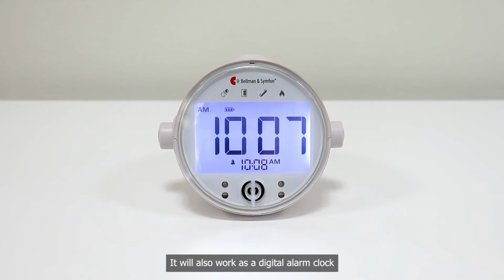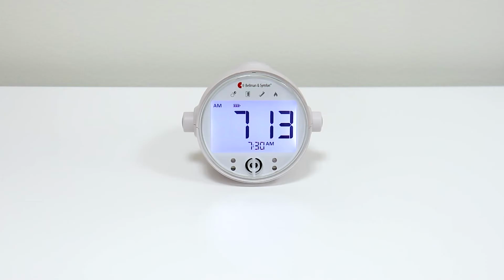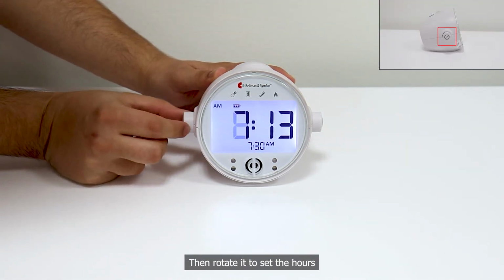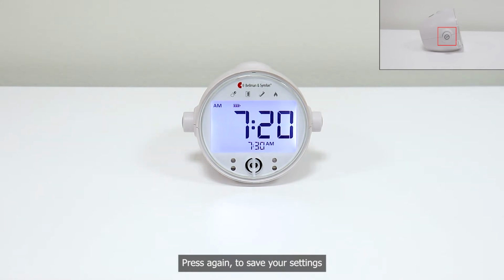It also works as a digital alarm clock, which will wake you with a loud alarm, flashing lights, and vibrations from the bed shaker when it is time to wake up. To set the time on the alarm clock, press the time setting button on the left. Then rotate it to set the hours. Press the button again and rotate it to set the minutes. Press again to save your settings.